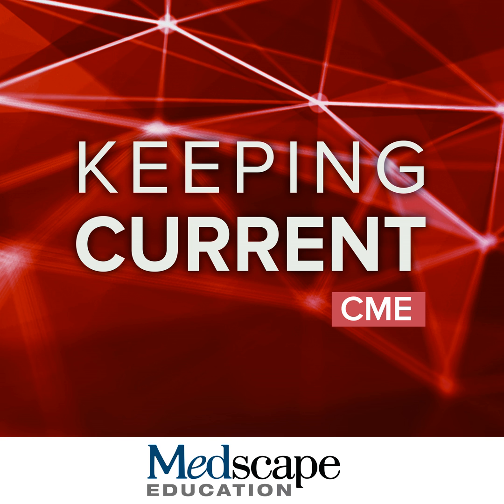But really, this is my approach to acute myocardial imaging. The key components are the edema imaging, whether you're using traditional T2-weighted sequences or your T2 maps, as well as your LGE imaging, and really commenting not only on the distribution, but the transmurality, which is really important for prognosis, and then looking for some of those complications like microvascular obstruction.